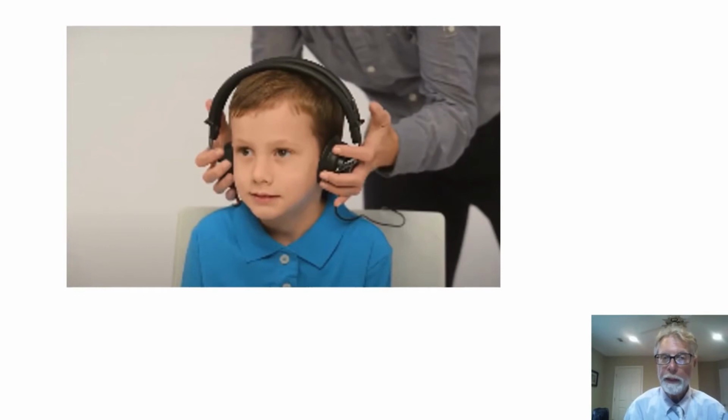And then you would put the headset on the patient, ensuring that the red earphone is on the right and the blue one is on the left. And we are talking about the patient's right and left. And you're adjusting the headband, headband's adjustable, so that the headphones are squarely on the patient's ears, and they're not going to fall down over time and sag below the patient's ears, right? You want to adjust the headband.